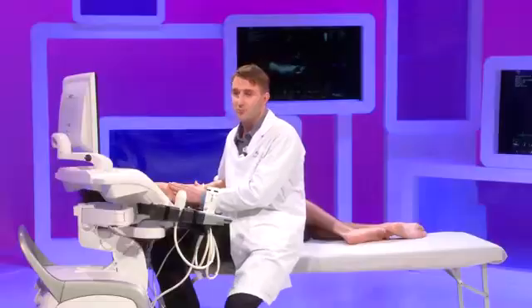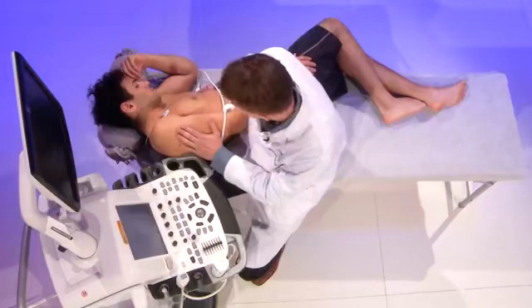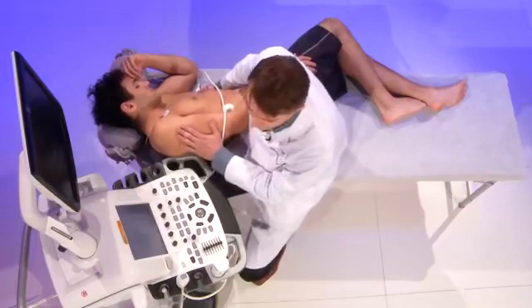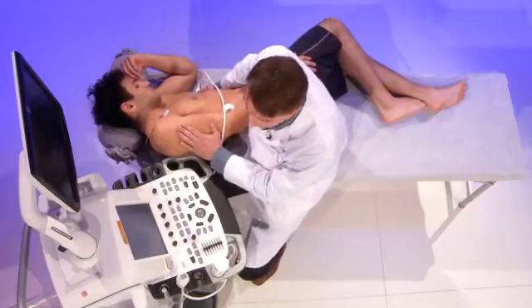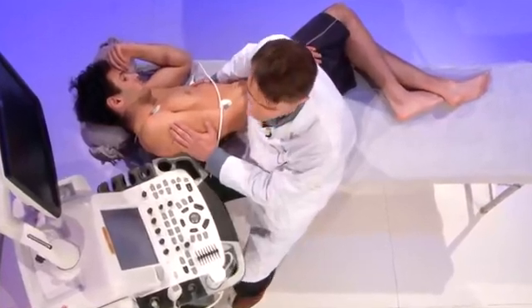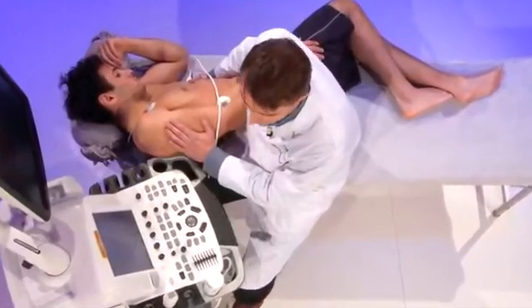It's very important to set up your echo machine well, to get optimal image quality and to make the right diagnosis for your patient. Before you start an echo, it's very important to make sure your patient is lying comfortable on the table on his left side, with his left arm up to open up the intercostal spaces, and with his left arm next to his head, not under his pillow, so as not to have muscle tension, because when you have muscle tension, you will have less quality of your echo images.